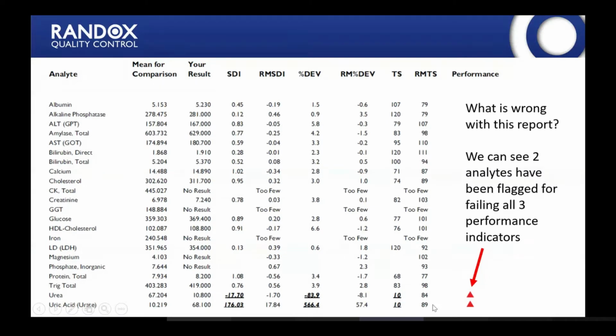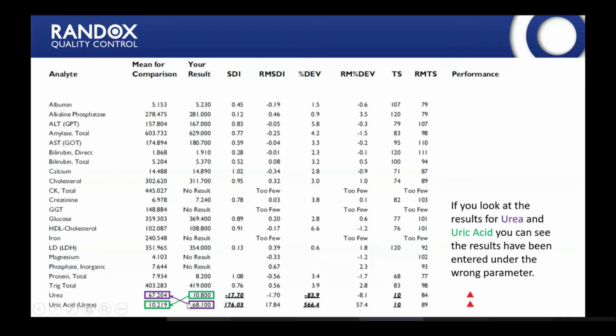We're flagged for our 3 performance indicators, and we have the red triangle. So if you look at the mean for comparison and the lab's result, you can actually see they've put the urea result under uric acid and the uric acid result under urea. So they've actually mixed these 2 results up. And you can see that if they put the result in under the correct one, the performance would have been good. The lab's result was 10.8 compared to 10.2, and the lab's result for urea was 68.1 compared to 67.2. So actually, if the lab had not mixed them up, their performance would have been good and nothing would have been flagged. But because they've mixed them, we have our performance flag.